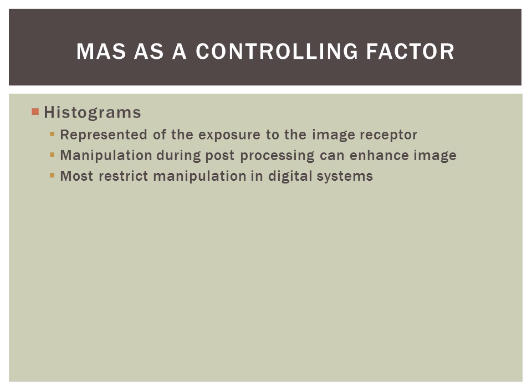Histograms: representative of the exposure to the image receptor. Manipulation during post-processing can enhance the actual image. Most restrict manipulation in digital systems. But again, it is your responsibility as a technologist to know how to compensate or adjust these.